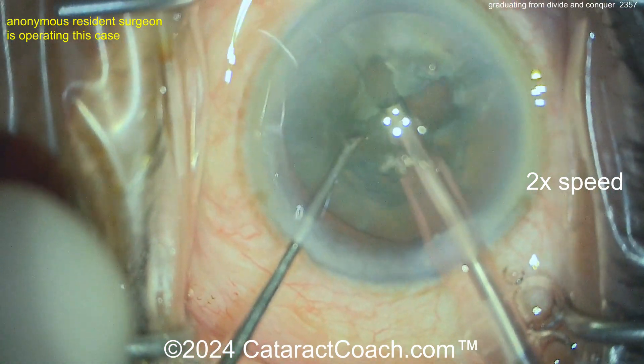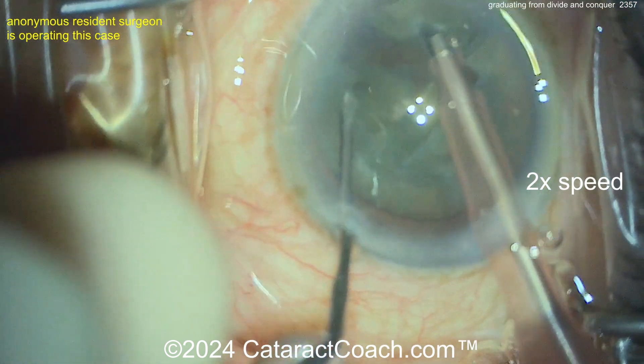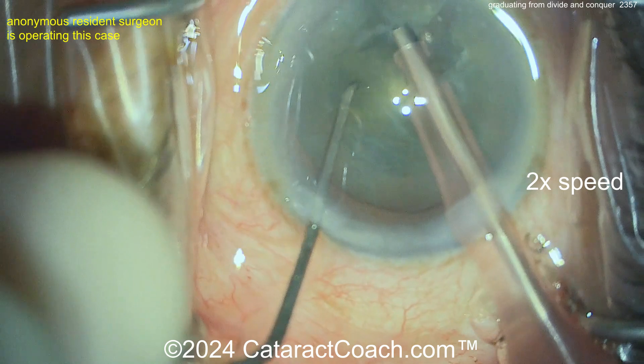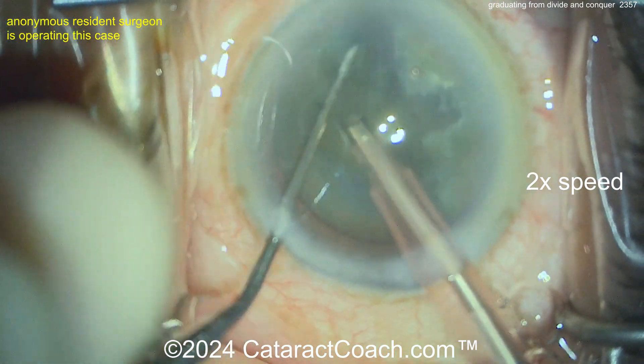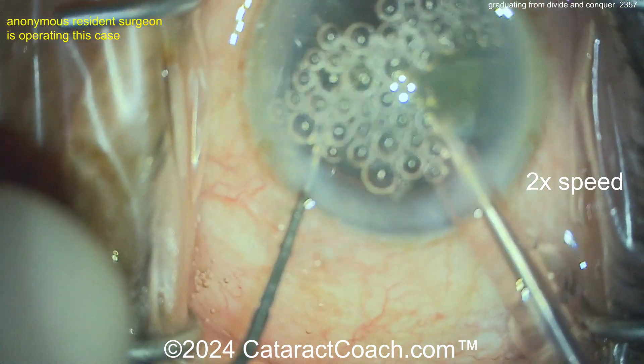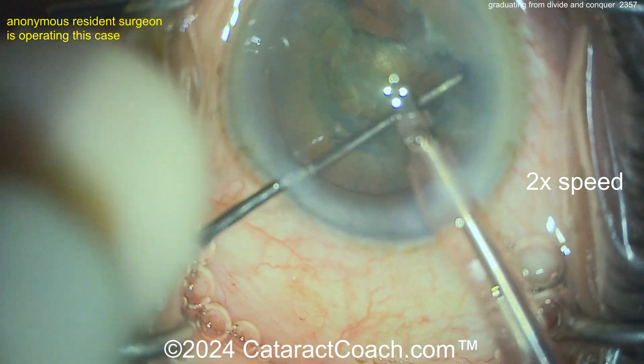Now another groove — this is all using a grooving setting. What would the settings be here? Moderate power — you don't need too much — and relatively low vacuum and low flow. You don't need much vacuum here, just for the material that comes out. Here's a quadrant coming up — very nicely done.